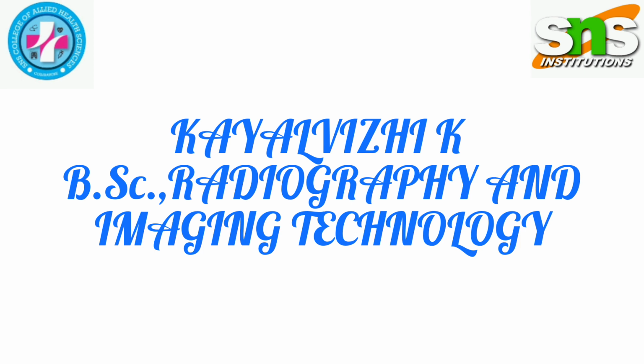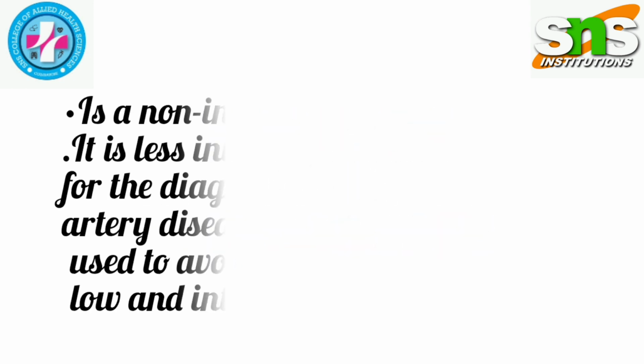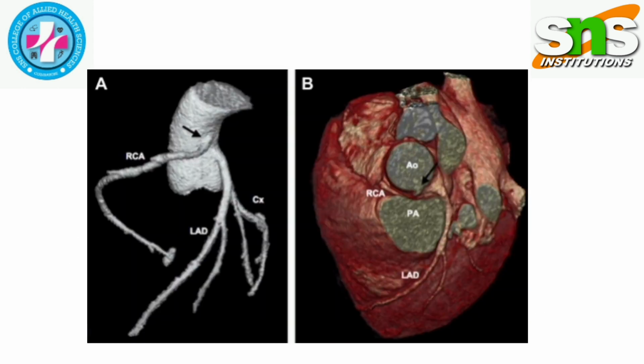Health Sciences. Here I am going to share my article about coronary CT angiography. An introduction: CT coronary angiography is a non-invasive method to image the coronary arteries. It is a less invasive imaging modality for diagnosis of coronary artery disease like CAD and is used to avoid coronary angiography in low and intermediate risk patients. The cardiac is highly motion due to physiological function, hence it requires a fast scanning mode.